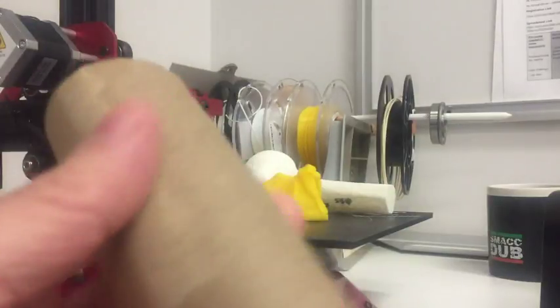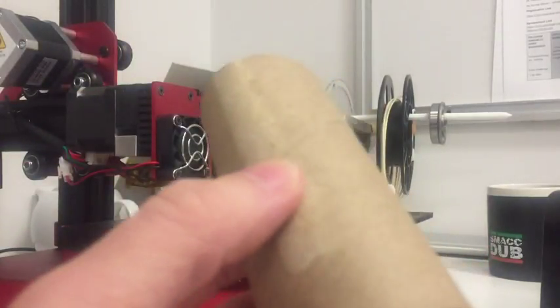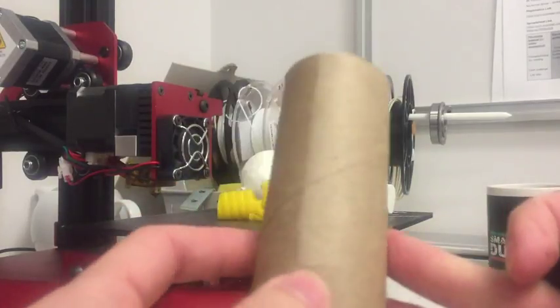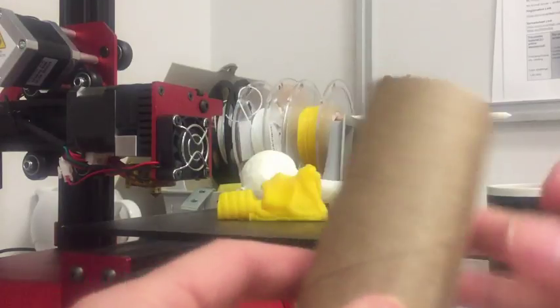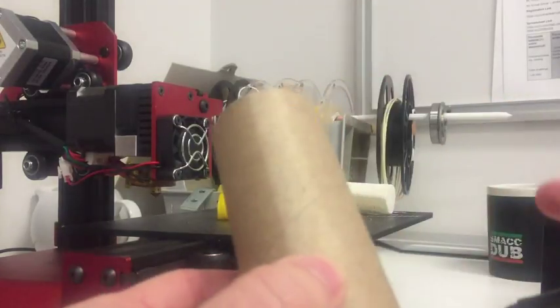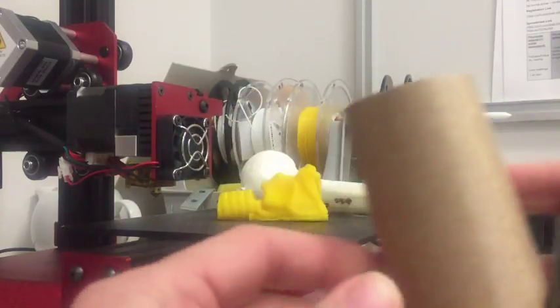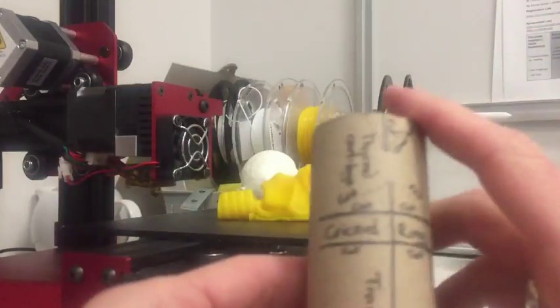And so it's fairly quick to make. You can get people to sit down at a workshop and actually make their own laryngeal cage, and I think it helps because it gives you some ideas about the anatomy that you're about to tackle, rather than just getting a piece of plastic stuck in front of you and getting going with the scalpel. So I'm just going to do it quickly here and show you what I did.